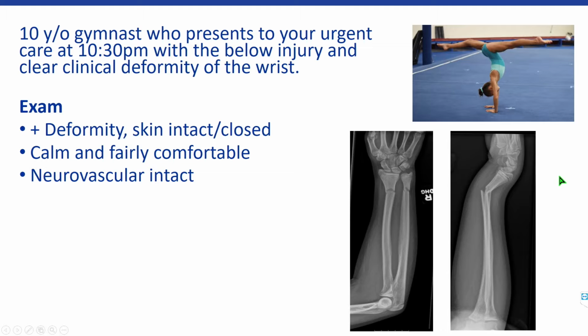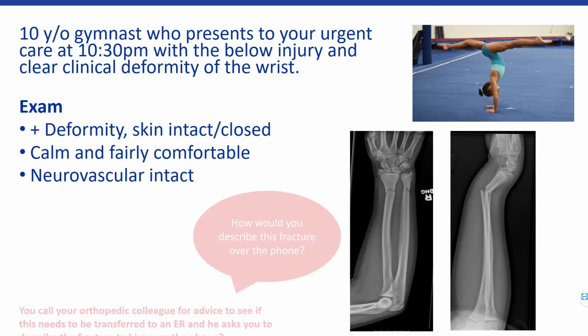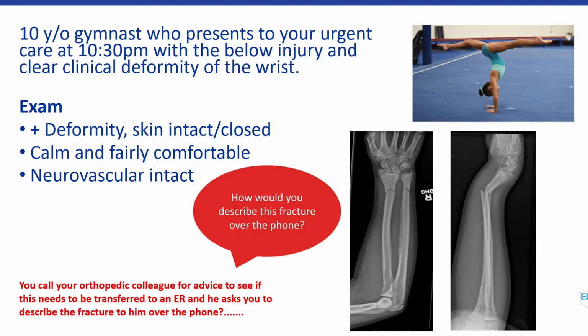Is this safe to splint? Not really sure what to do with this. So, like we often do, we phone a colleague. You reach out to your orthopedic colleague to ask for advice. He informs you that he's in an area with really poor reception and service, so he's not receiving the images you're sending him, but he wants you to just describe it over the phone.